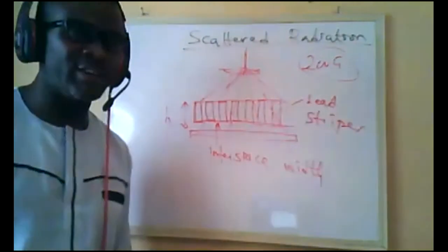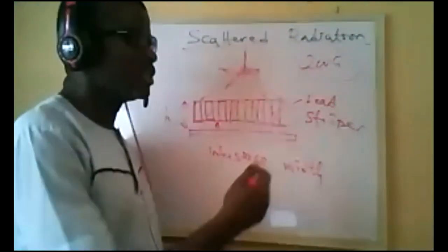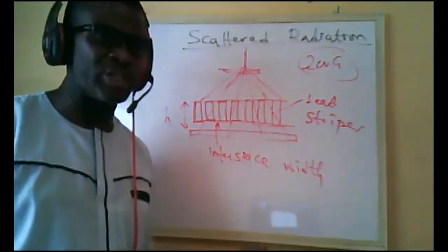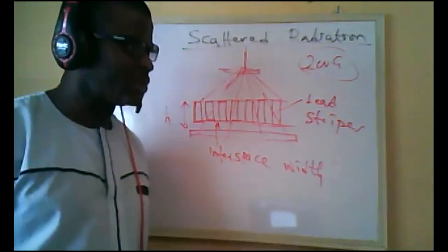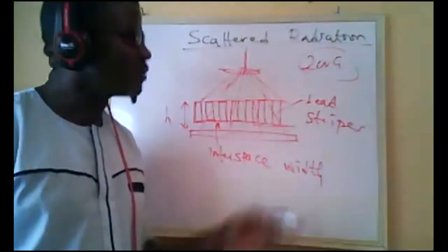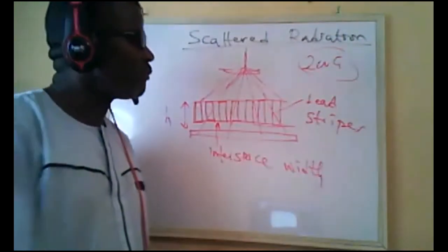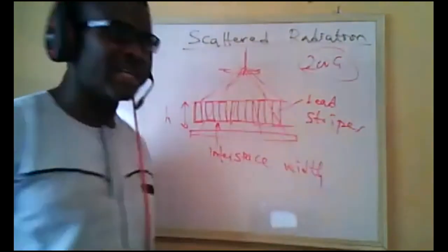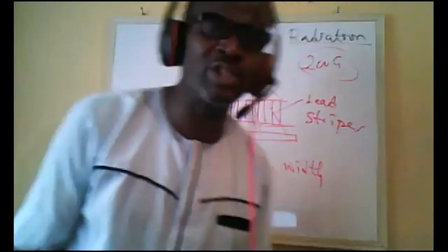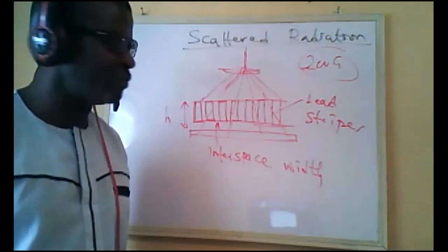If it's not there, and we want to save the patient by giving a lower exposure, at the end of the day you might have to take two or three exposures, so we end up wasting our films. Of course, this is for screen-film systems, but even for digital you get this. That is why one has to be very careful when dealing with digital technology, because since you're not using film, you just look at it on the screen.